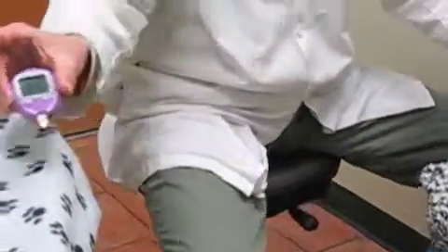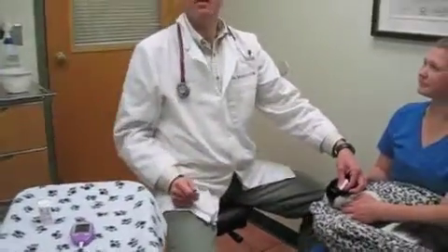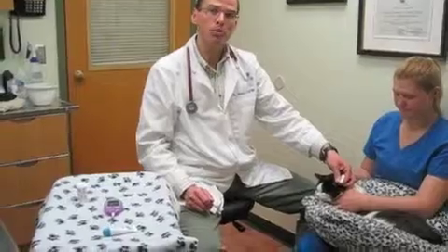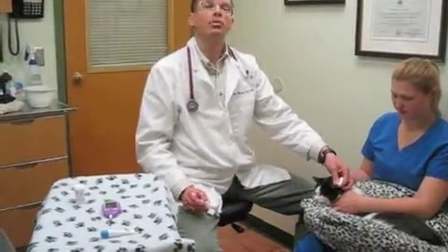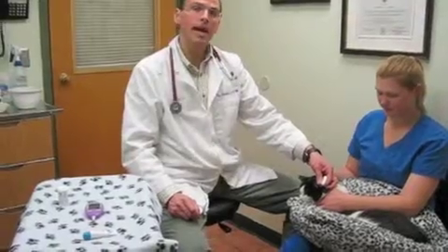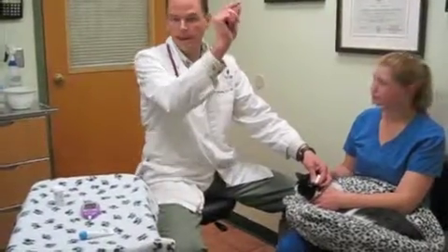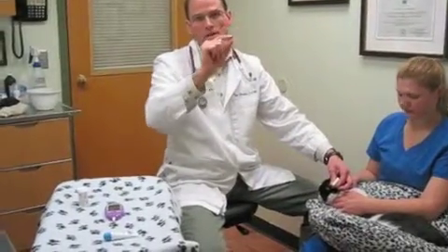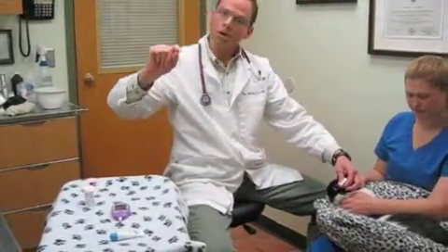And we have a nice reading at 92 — that's normal. Your veterinarian may have you do this once or twice daily, or just the occasional blood glucose curve where you will take a blood sample in the morning at breakfast and give insulin. At that point your blood sugar is the highest, and then through the day every two hours you'll take a sample, seeing the blood sugar come down and start to go back up as it's time for another shot and a meal 12 hours later.